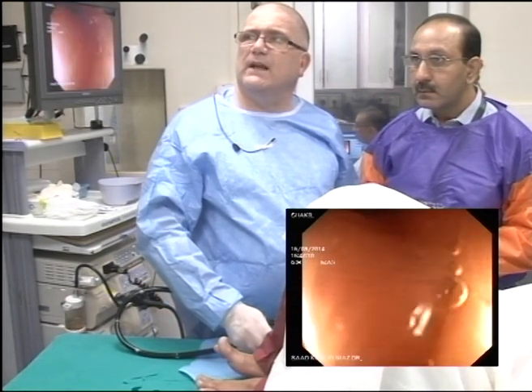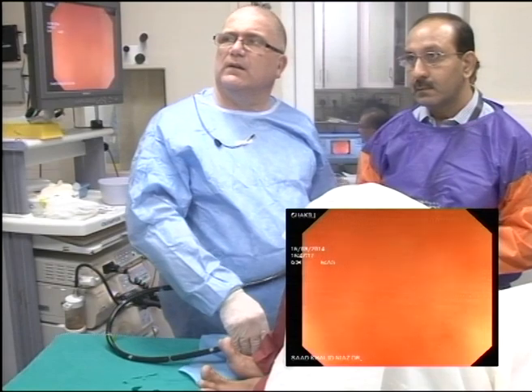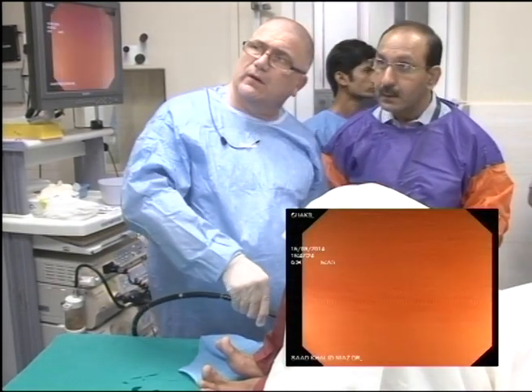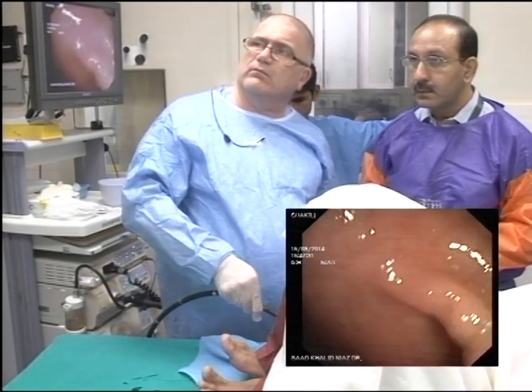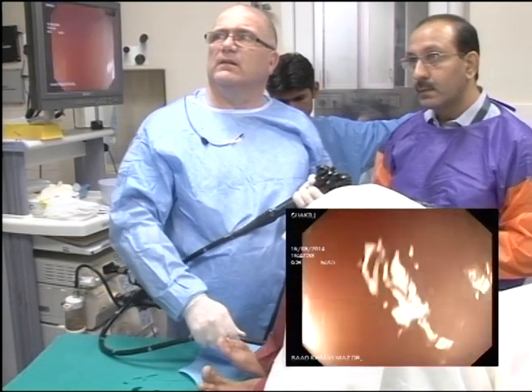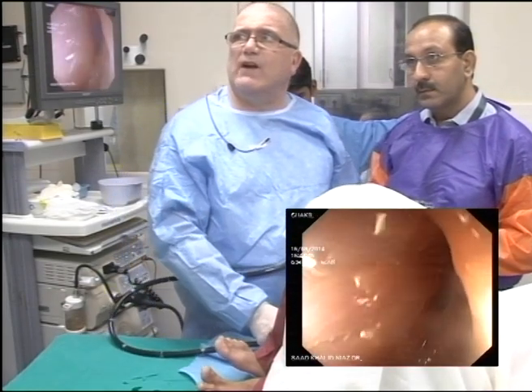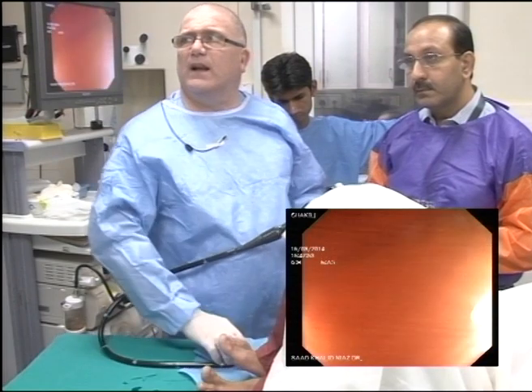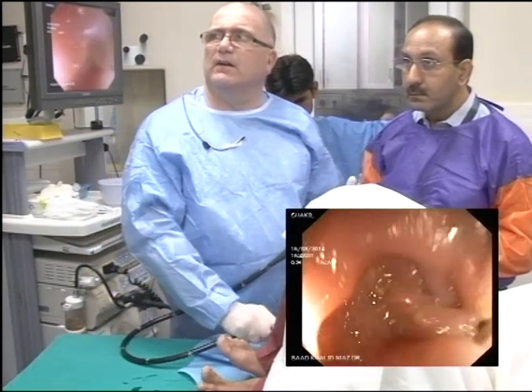Now if this is difficult for him again, this is a chap that we will bring over onto his right side. Now if you see what I'm trying to do, we're actually using anti-clockwise torque. Yes. And what that's doing is it enables us to actually reduce the scope. There. See it? So we're under that fold now. And then just to there. So all of this is to try and get up to straight. As we go forward, again, a little bit of air, on and a little bit of air. And again, anti-clockwise, and then clockwise.